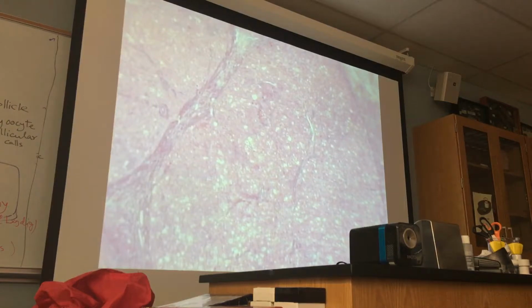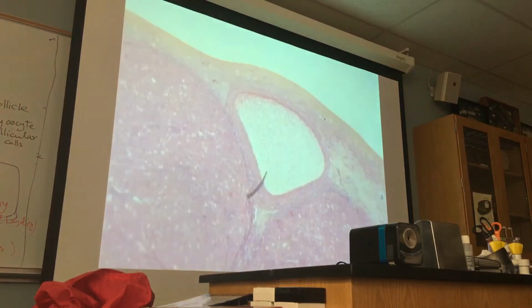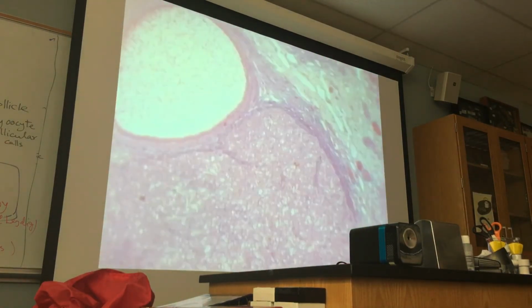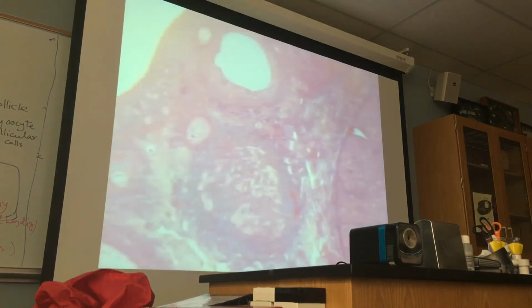Now, after this cycle, this will degenerate, isn't it? Now, how does a degenerating corpus luteum look like? It's here. There is one.